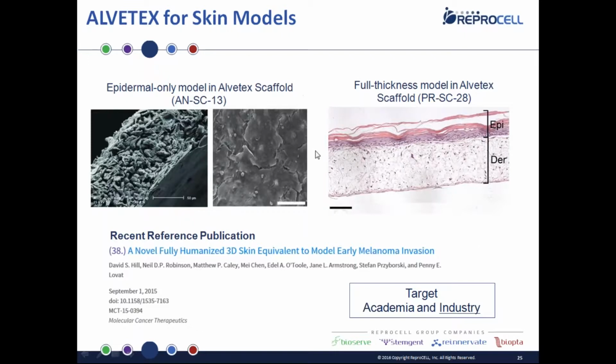Another model which is very popular, mostly with industry people, which tends to have much more money involved, so we like our industry people, is the skin models. We have two skin models. One is epidermis only in Alvetex scaffold.